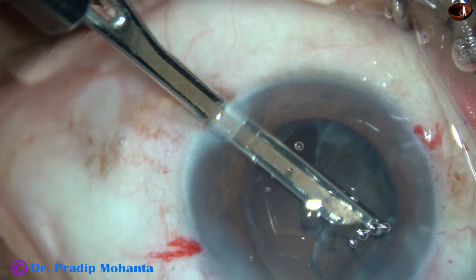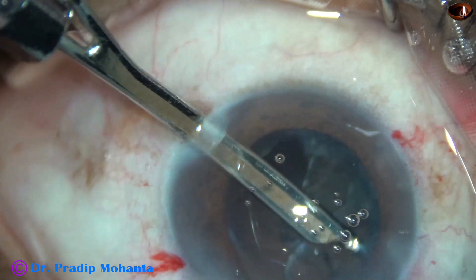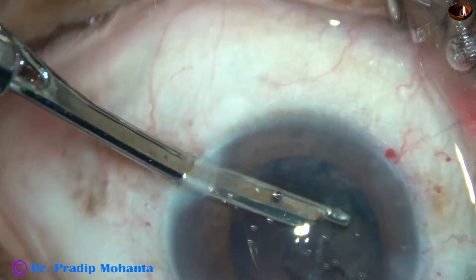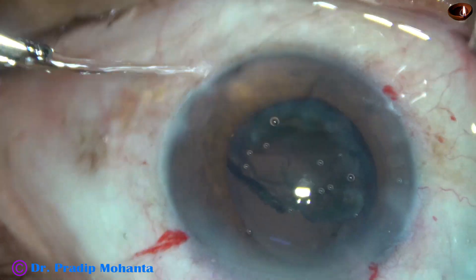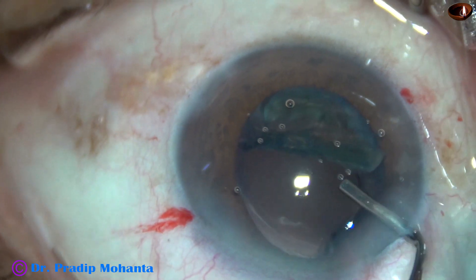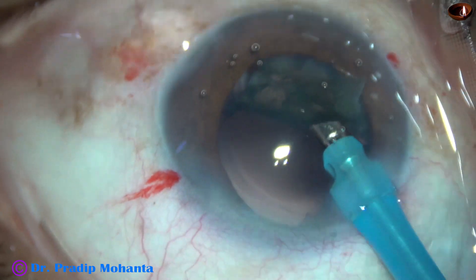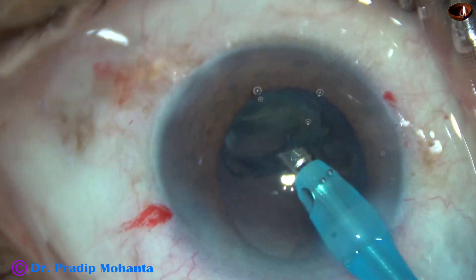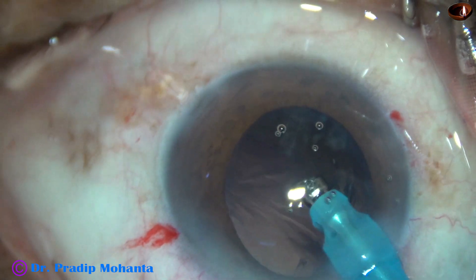The nucleus and left half of the epinucleus has been removed. Now I inject visco and place this half of epinucleus inferiorly with the help of the Szynski hook. Then I come out, inject some visco behind this epinucleus sheet, and use low vacuum and low flow rate to remove this piece of epinucleus.